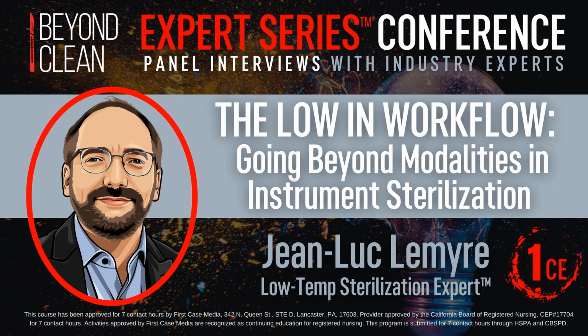Right. And so if you had that residual hydrogen peroxide in that one localized spot where there was too much water, could that potentially be a risk factor to people handling the device after the sterilization cycle? It could. Yeah.